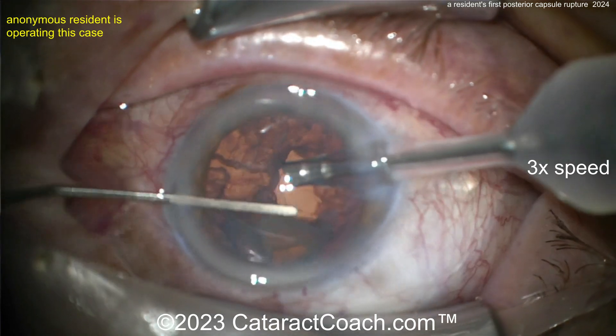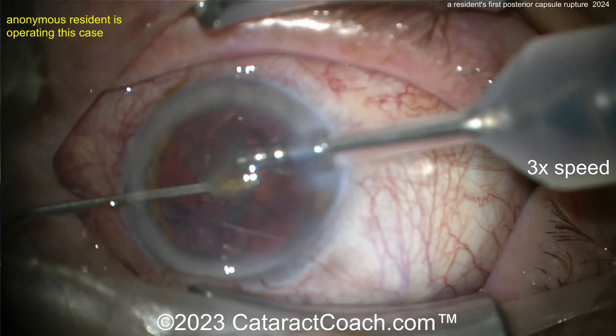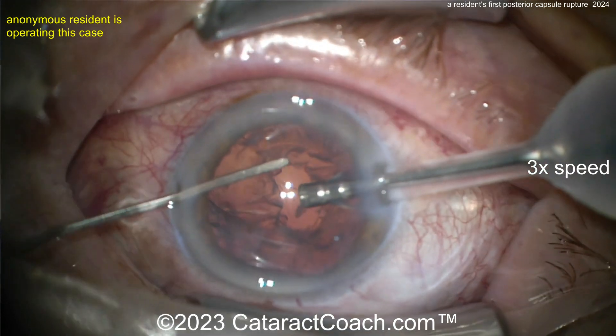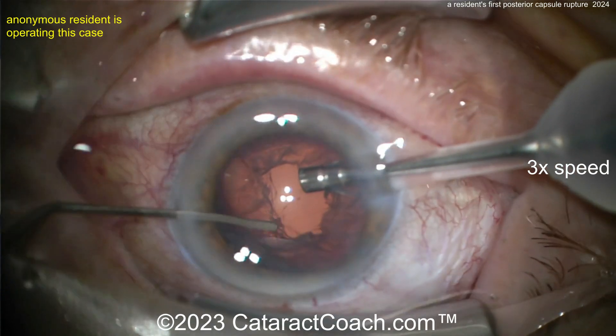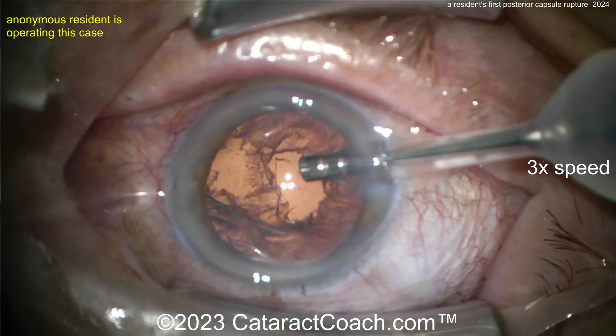The capsule is broken — it's already punctured right there. That hole is going to expand. You can try to get the remaining pieces out, but I would have stopped right here: kept the probe in the eye with the non-dominant hand and injected viscoelastic to make a barrier, then removed that last bit of nuclear piece. You definitely have some vitreous prolapse here.